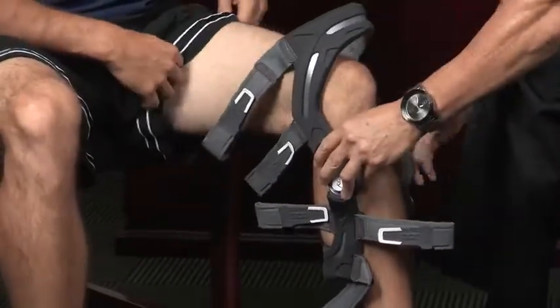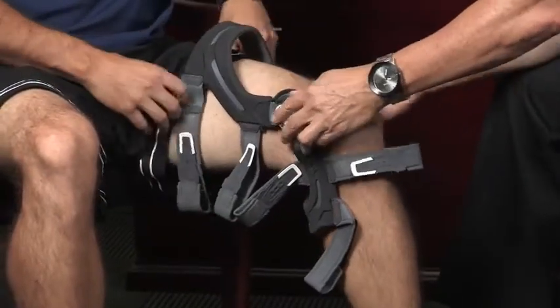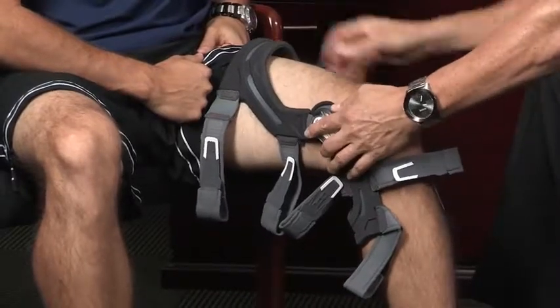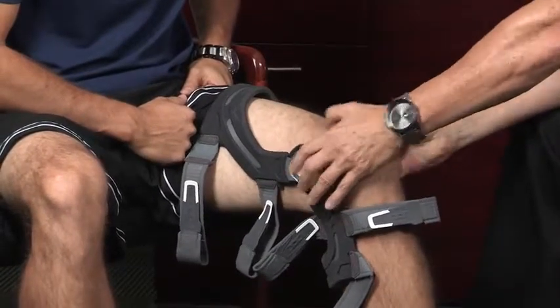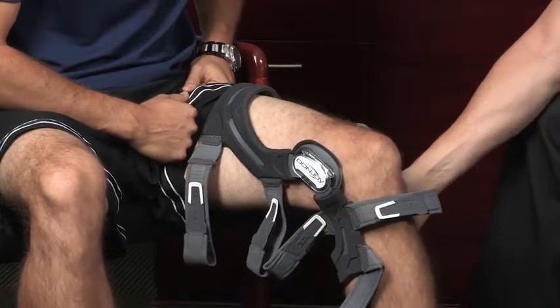As you notice, I've got Nick sitting down, which is really important. It's hard to put a knee brace on when you're standing up, so I prefer to have you sitting down with your leg bent at about a 30-degree angle. You've got the hinges that are just above your condyle, or your kneecap here, and they're a little bit posterior.